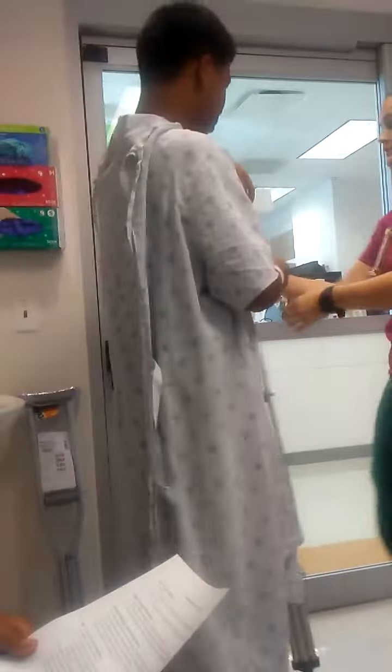All right, go ahead and put this back on you so you have this. Let's drop your arm straight down.